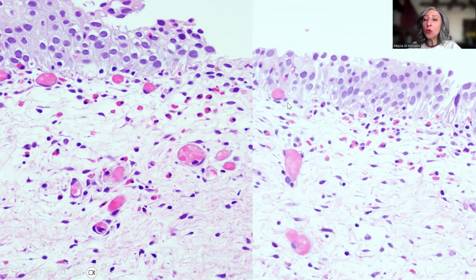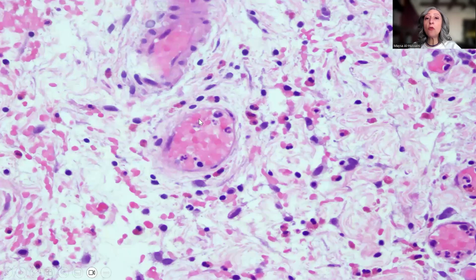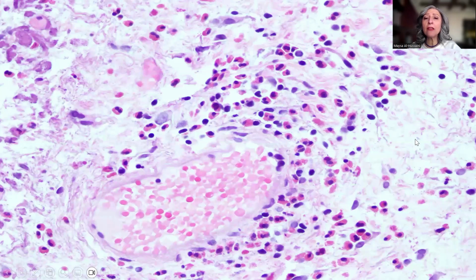But again, if you look at the urothelium itself, it harbors many eosinophils, and if you look at the subepithelial connective tissue, there is edema, congestion of the vessels, and plenty of eosinophils. And to zoom in into the subepithelial area, where we have the congested vessels, the edema, extravasated red blood cells, and plenty of eosinophils. Look at this focus.